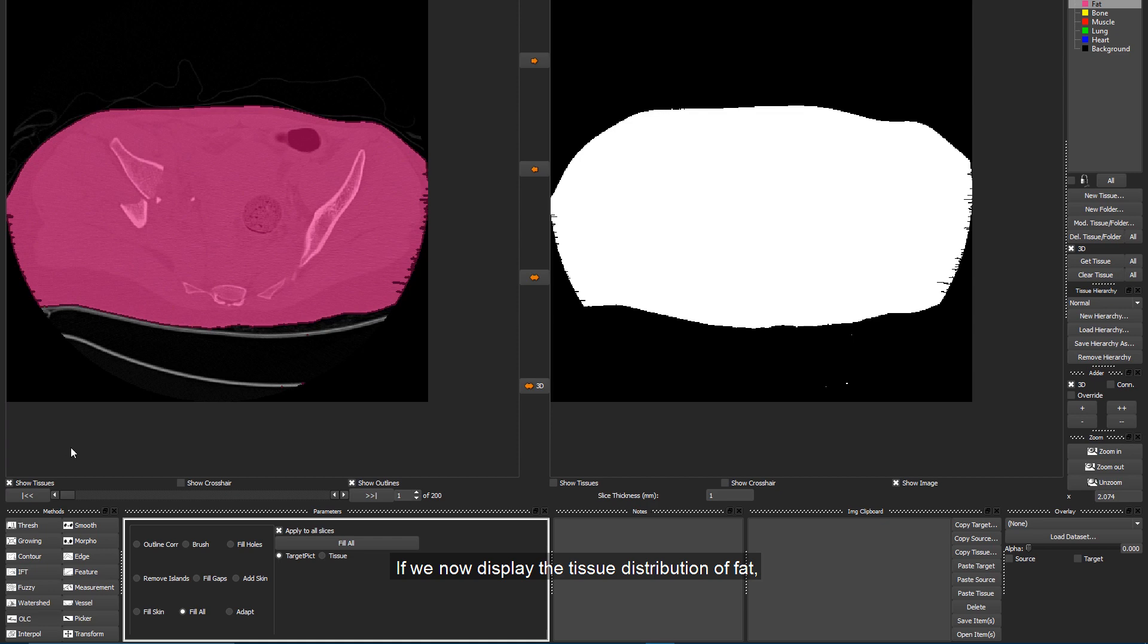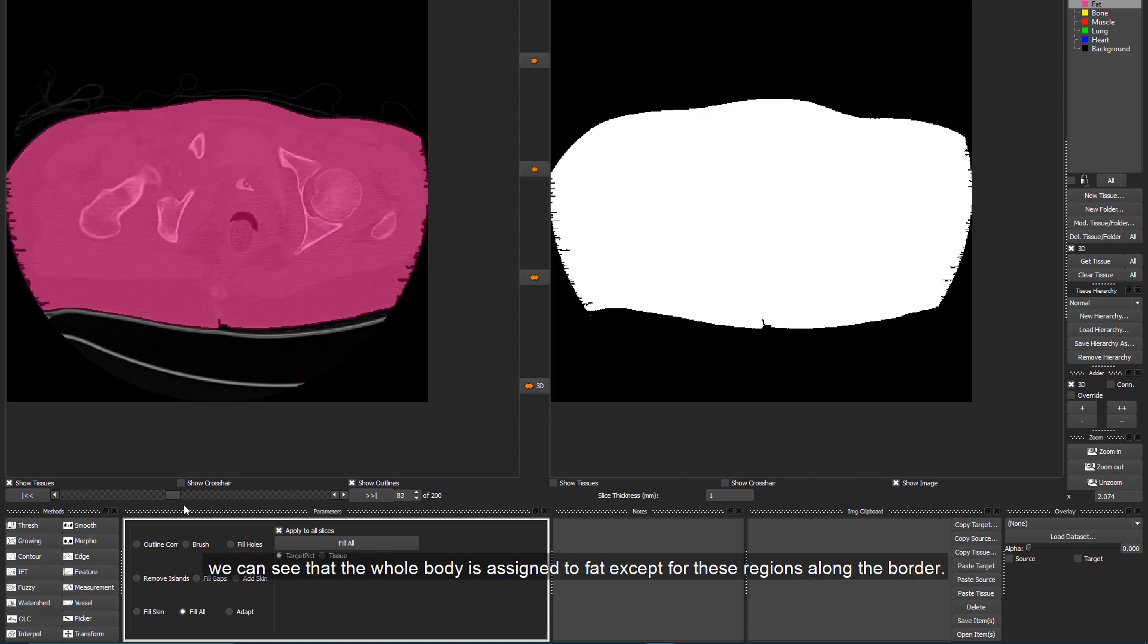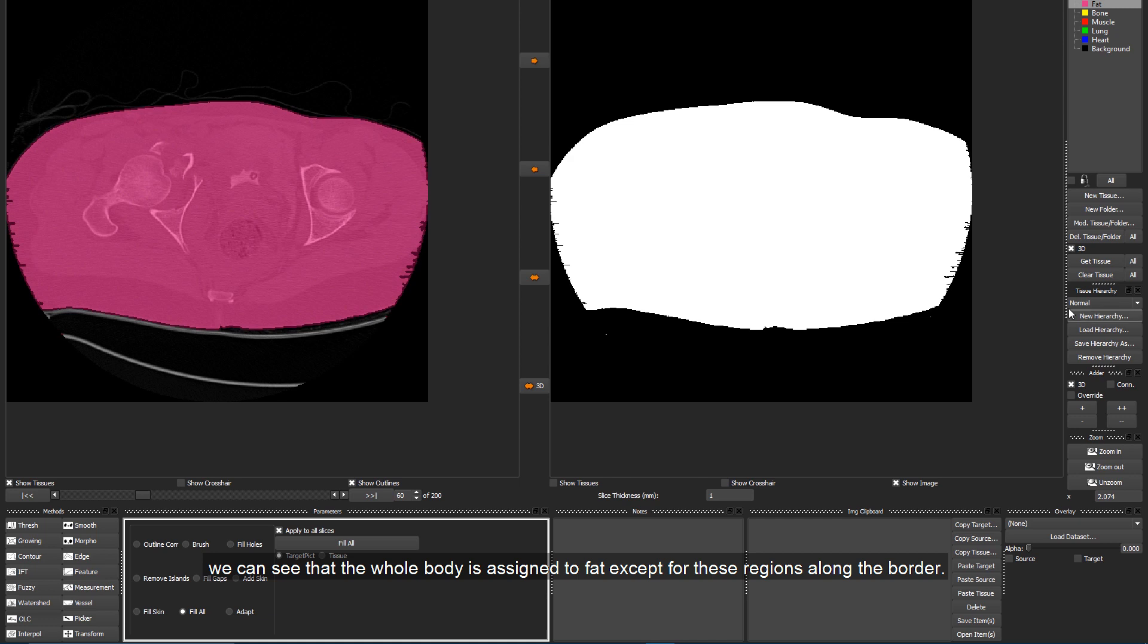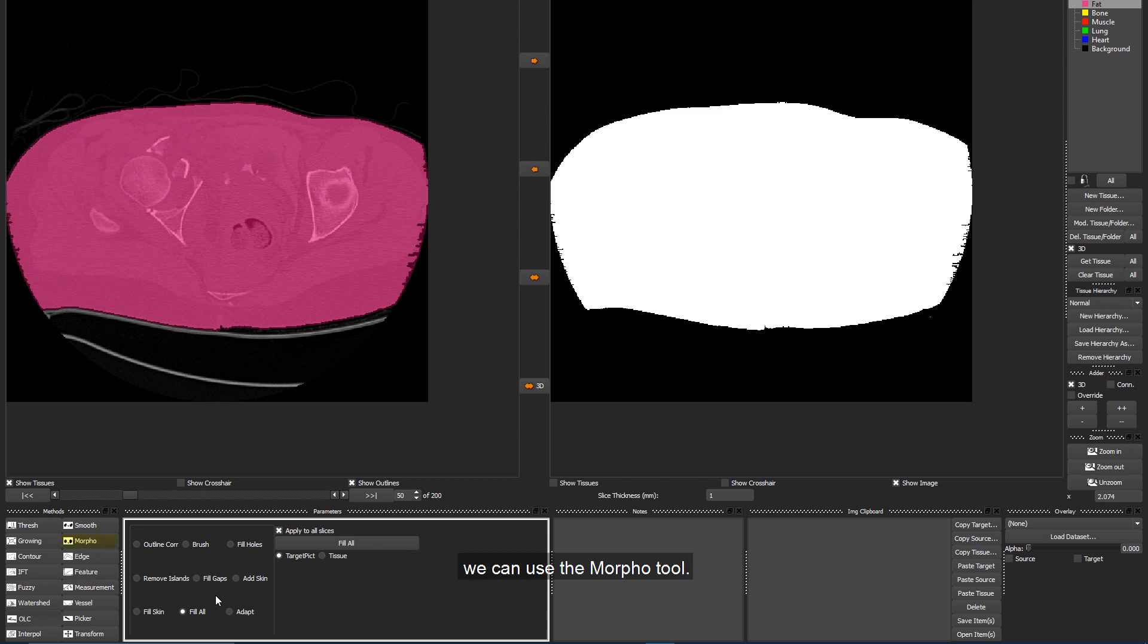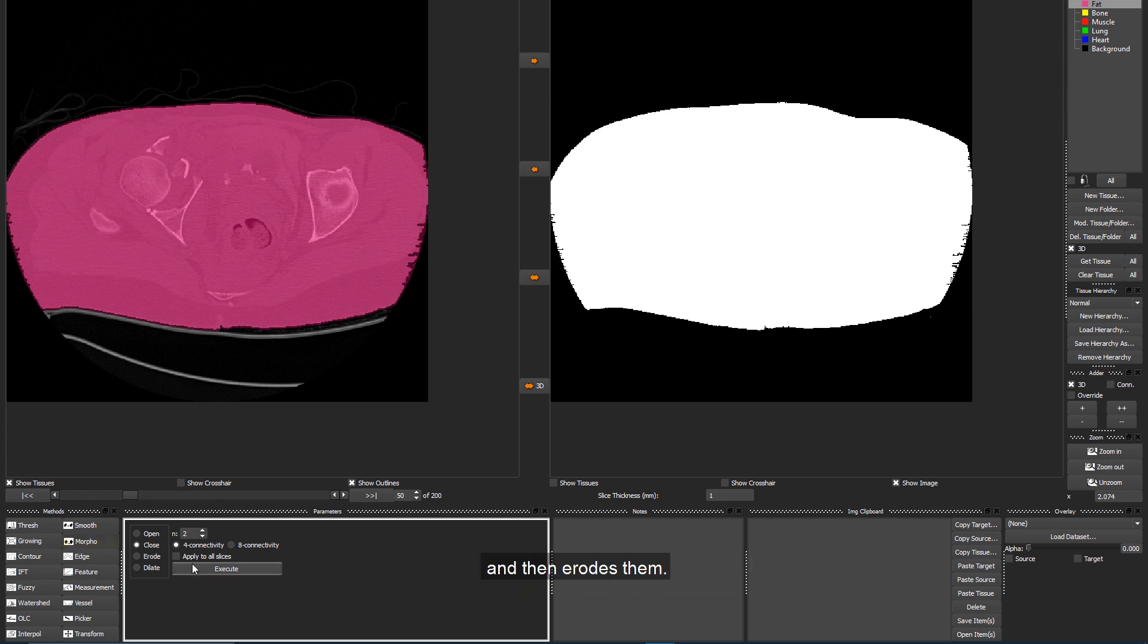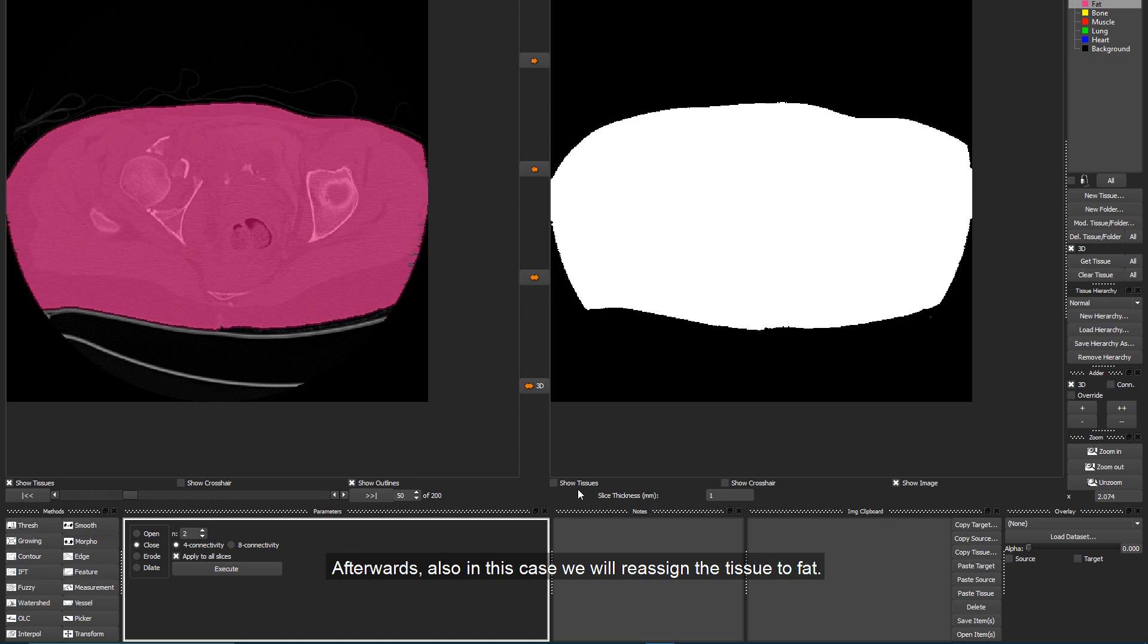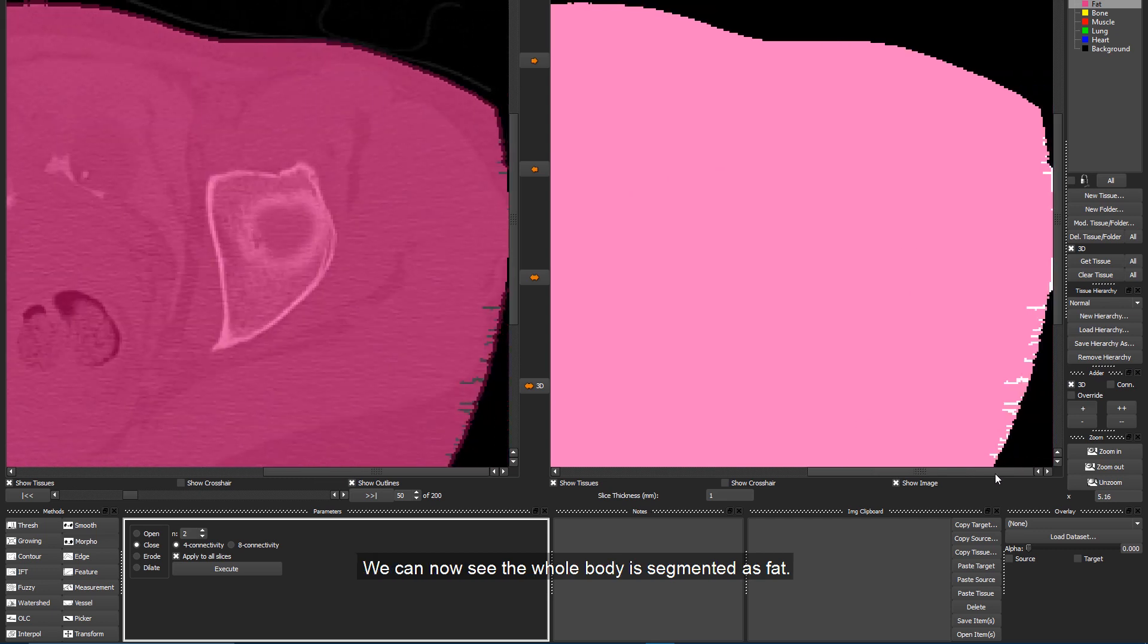If we now display the tissue distribution of Fat, we can see that the whole body is assigned to Fat, except for these regions along the border. To remove the holes along the border of the body, we can use the Morpho tool. We will use this function with the Close option enabled. The Close function first dilates the selected region and then erodes them. As a consequence, holes in the regions are removed. Afterwards, also in this case, we will reassign the tissue to Fat. We can now see that the whole body is segmented as Fat.